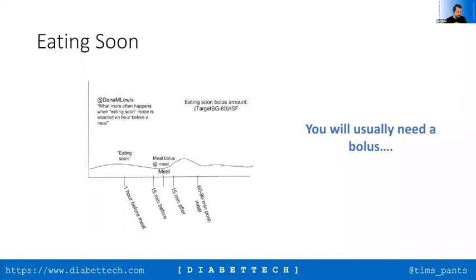So Tony said, trouble is I don't tend to eat at a set time, it always varies around a time-ish, but never dead on. No, that's not really important, because the thing you're trying to do is get more insulin on board to get you to a lower temporary target. You're not trying to put in place the insulin for the meal. And if you do use the bolus calculator, when you then enter the details of the meal, it knows about the IOB and can deduct that from the amount you require for a meal bolus.